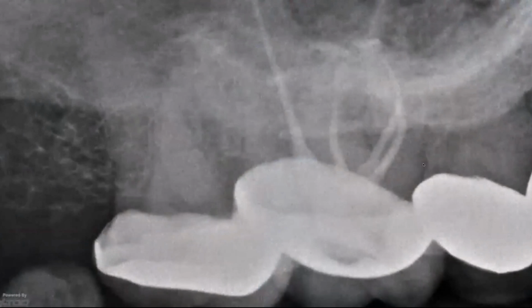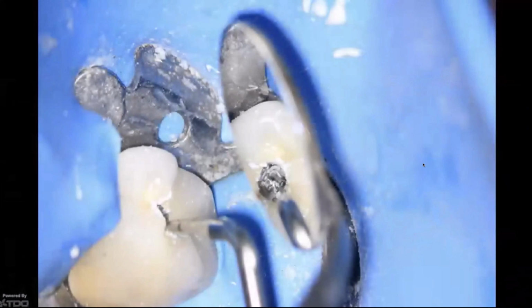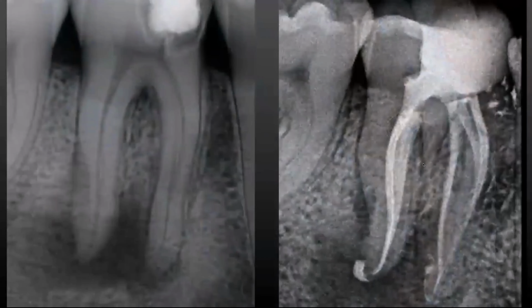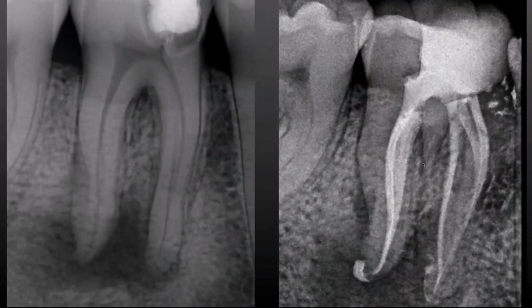So that's just an example, with an MB2. Again, similar concept. This would be with a lower molar. Plugger is placed in the mesiolingual canal. Obtura is then placed in the mid-mesial and then backfilled. So it's the best way, without trying to fit cones at specific lengths, to be able to deliver sealer and gutta-percha into the system under hydraulics and really fill all that additional anatomy in the apical third of the tooth.